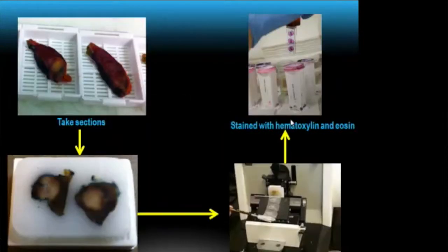So here, actually, I show you tissue sections on the H&E slide. This is actually tissue sections from a liver resection for metastatic carcinoid, a well-differentiated neuroendocrine tumor. And you see there's kind of a whitish tan nodule. That is the tumor, and the background dark red colored tissue is normal liver.